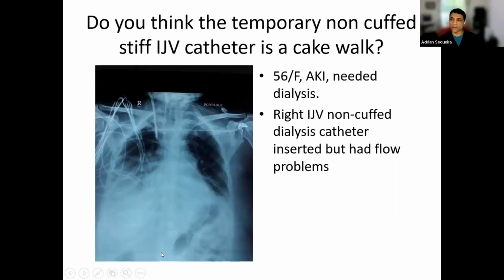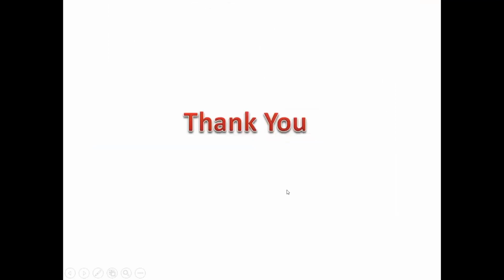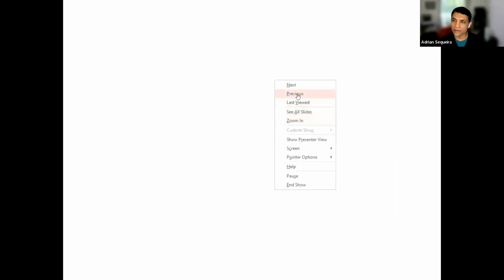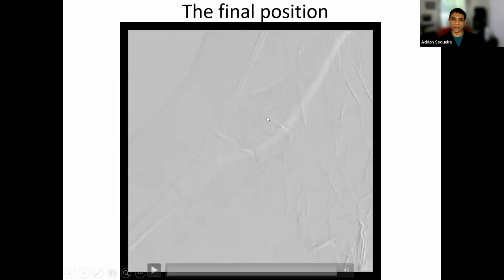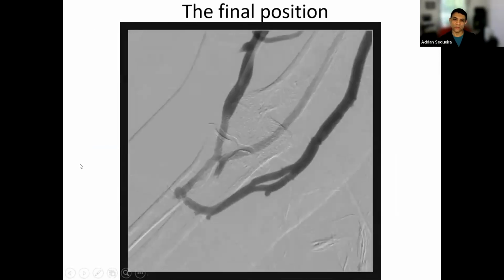So that was the snare, right? You used the snare to grab the balloon. No, the balloon he has used. No, we used the balloon. I'll show you. He used a balloon to anchor it, but how did he grab the proximal end of the wire? So we used the coronary wire. I'll show you, one minute. No, the one before this. One before this. Yeah.